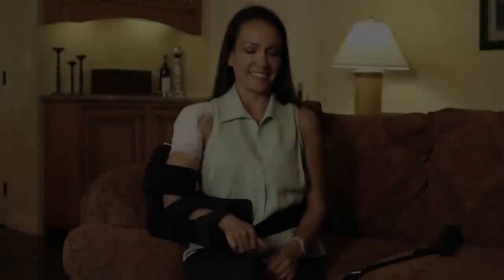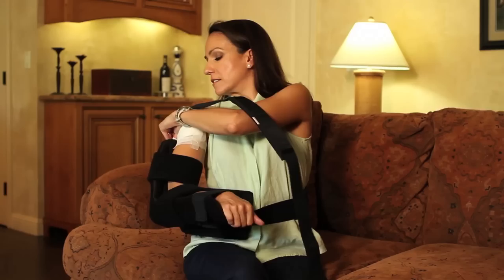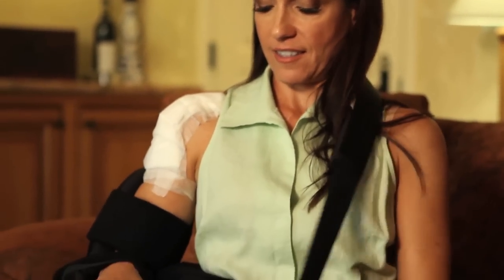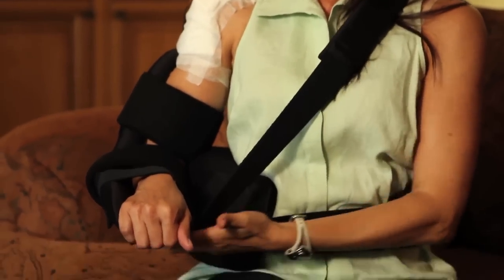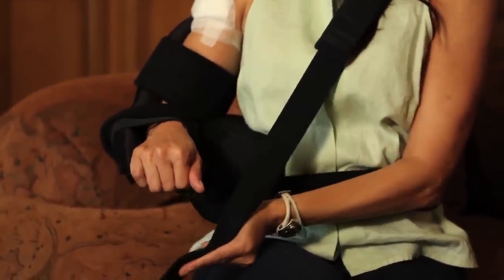The Shoulder Cradle is designed to work without a neck strap, but if additional support is desired for the arm, the optional neck strap can be used. Simply attach one end to the back of the cradle, bring it over the shoulder, and attach the other end on the underside of the cradle. The strap is elastic, and the tightness can be adjusted by moving the attachment points.